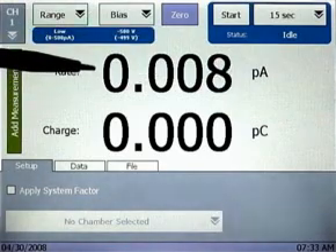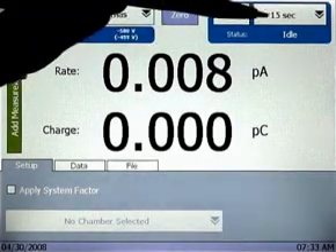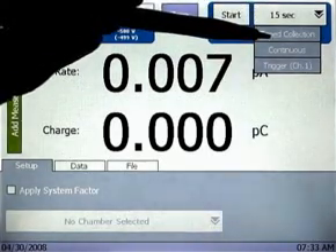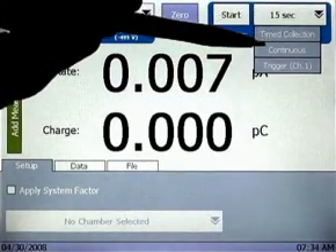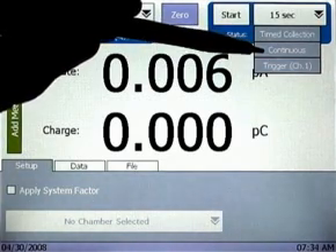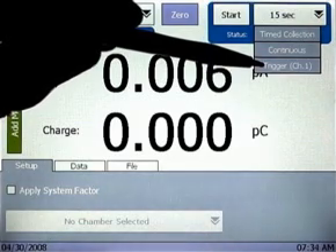Now that we have our settings selected, let's perform a charge collection. With the SuperMax, there are three charge collection modes which can be selected from this pull-down menu: Timed collection, which allows a specific interval to be entered with an on-screen keypad similar to the bias setting; Continuous, which allows for manual start-stop of charge collection; and Trigger mode, which allows for a charge collection to be automatically performed as the signal level rises above and drops below user-configurable thresholds.